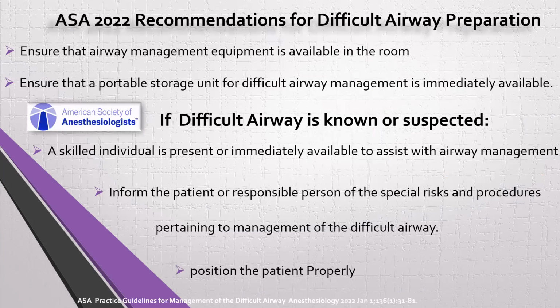So, the American Society of Anesthesiology 2022 recommendation for difficult airway preparation. You have to ensure that airway management equipment is available in the room. They recommend ensuring that a portable storage unit for difficult airway management is immediately available.